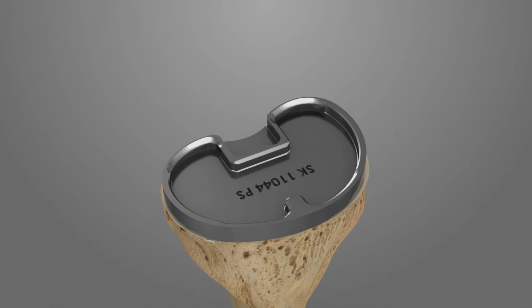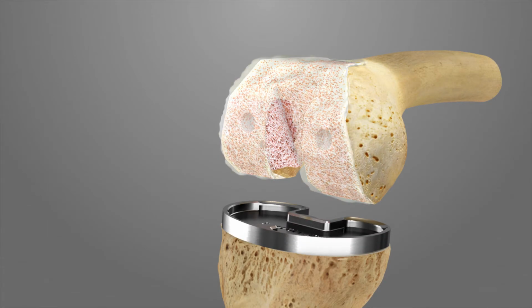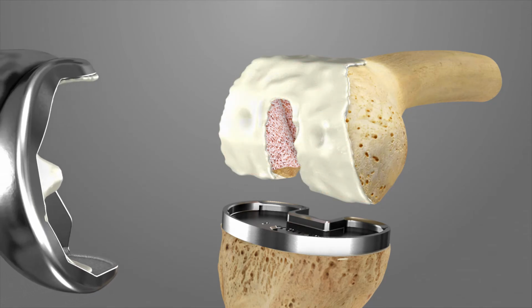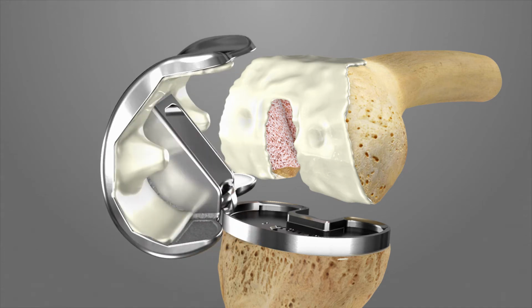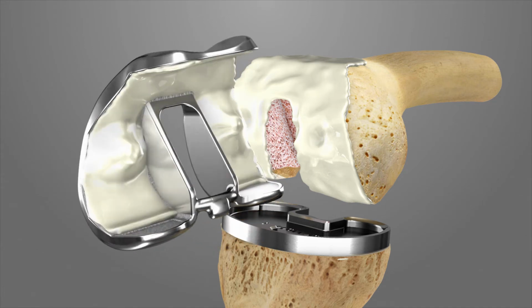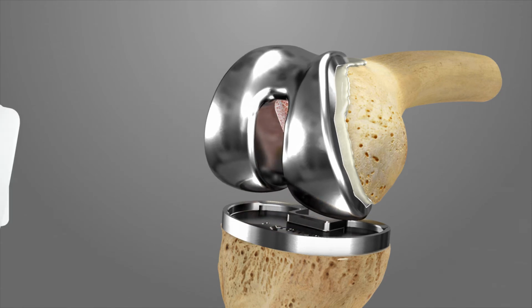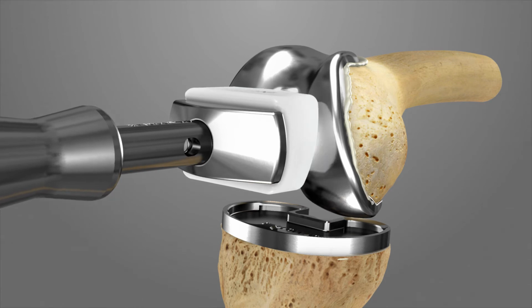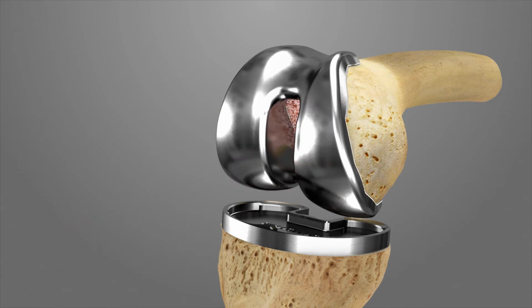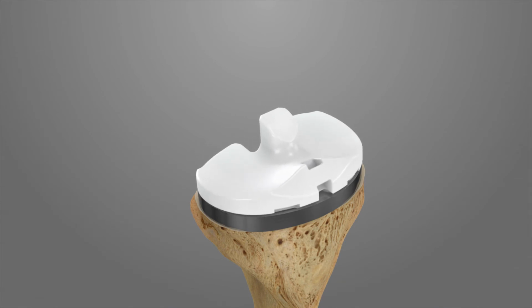Apply a layer of cement to the femoral bone while taking care not to apply cement on the posterior condyles. Then add a layer of cement to the femoral implant, applying less cement posteriorly to prevent posterior cement extrusion. Impact the femoral implant. Remove any residually extruded cement from around the implant. Select the appropriate trial insert and insert it into the tibial tray.